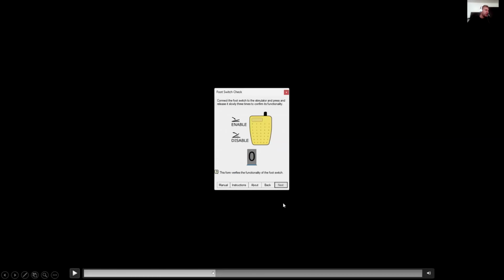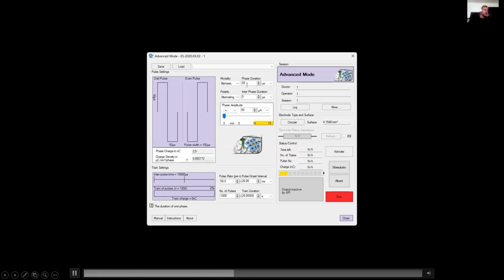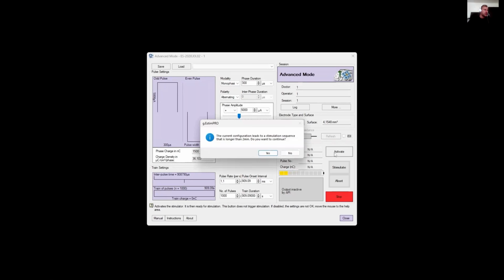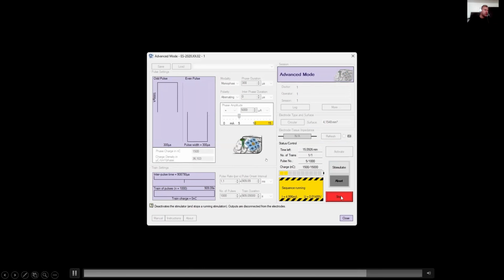For the stimulation here, we are utilizing a foot switch. With that, for example, we can step on the foot switch, and by stepping off, we have an, let's say, emergency exit. So we can immediately stop the stimulation with a hardware interrupt. That is also a very powerful feature. For example, if you customize stimulation protocols for a study, and you observe that the patient has a symptom or a seizure, you can immediately step off.